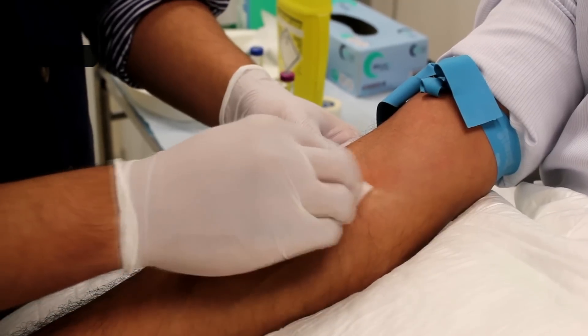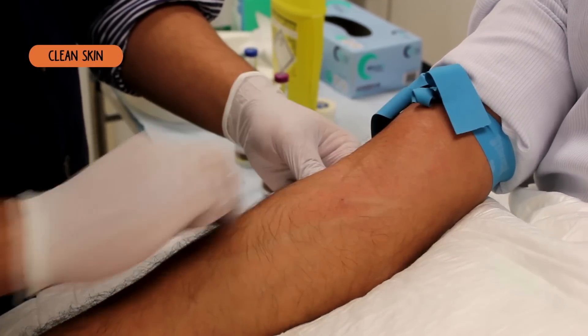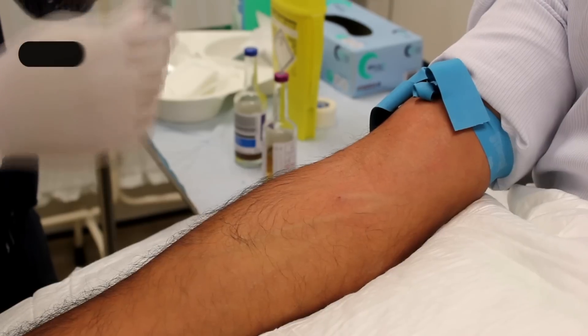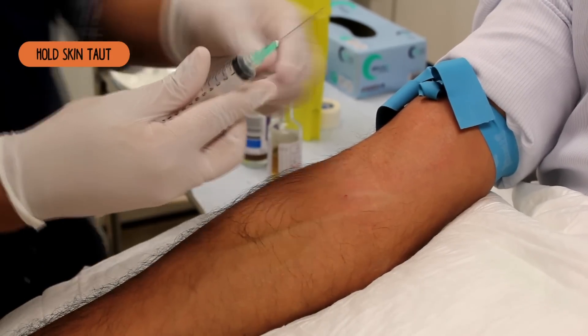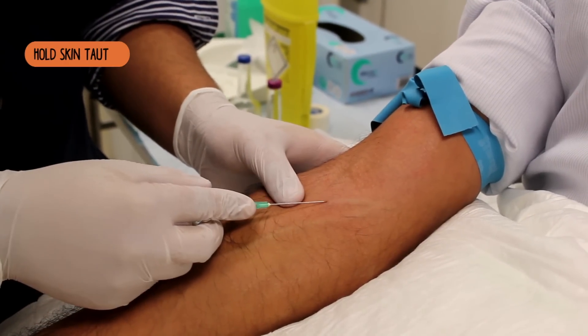I'm going to wipe the area with some alcohol. Sharp scratch coming up.